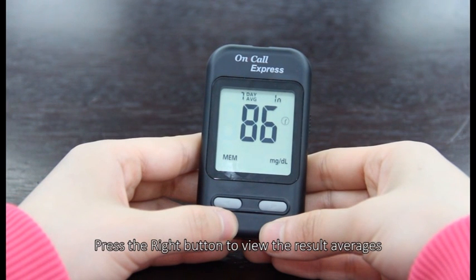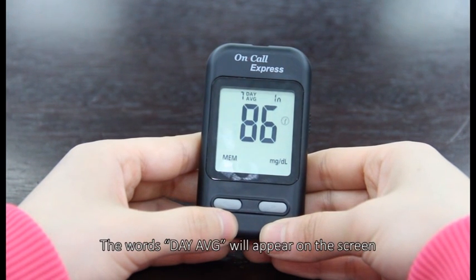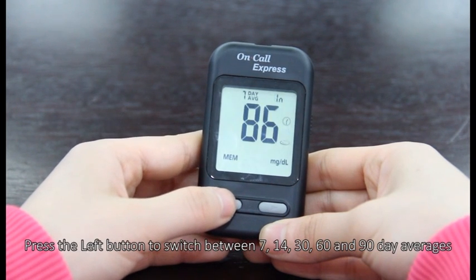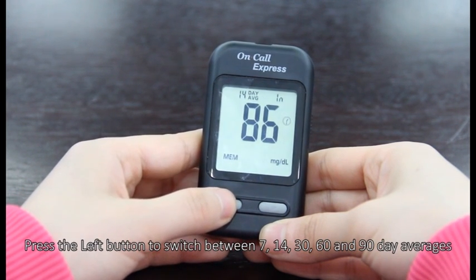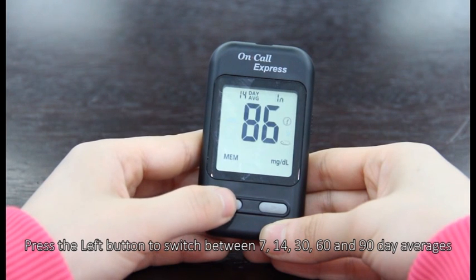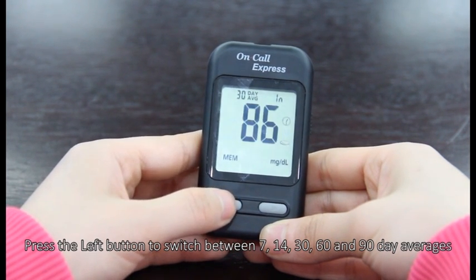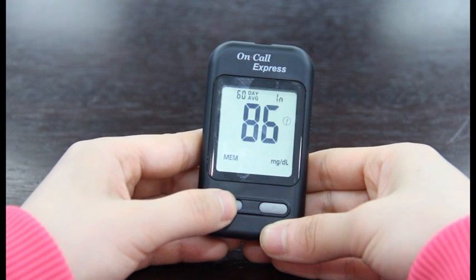Press the right button to view the result averages. The words day average will appear on the screen. Press the left button to switch between 7, 14, 30, and 60 day averages.